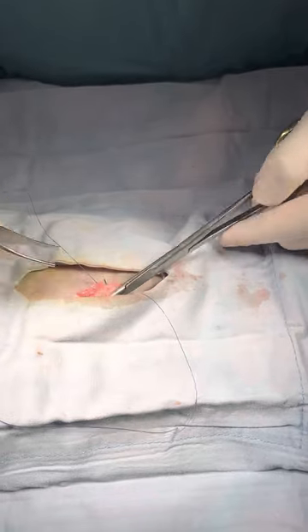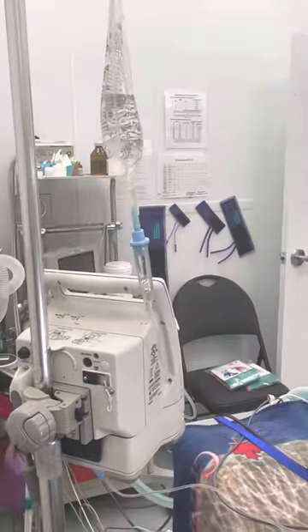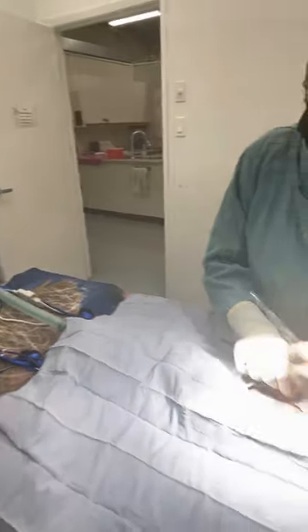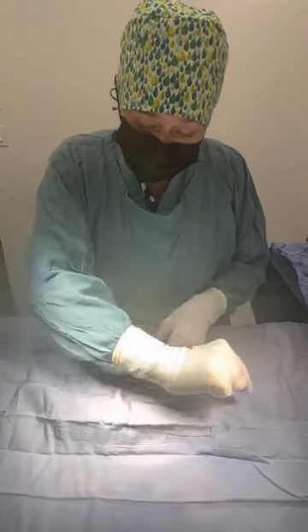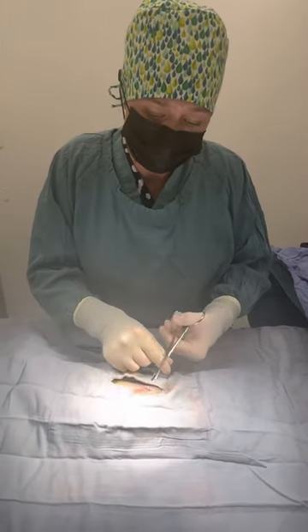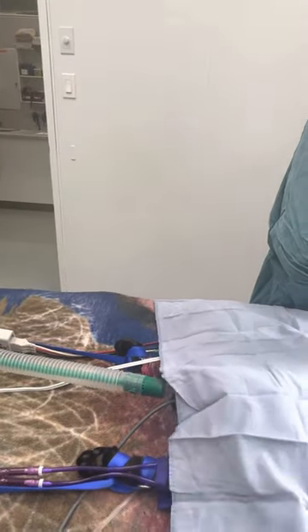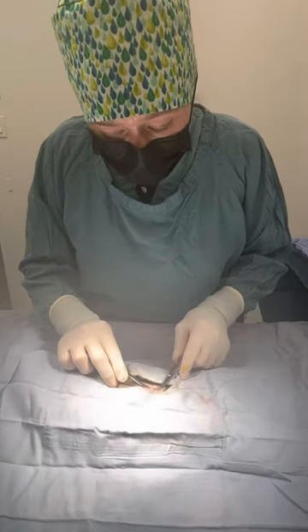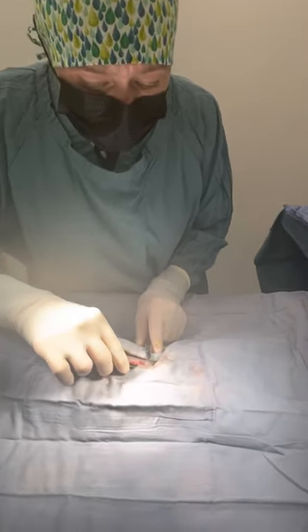You'll notice this cat is on an intravenous drip so we have full access to her circulatory system at any time. She's also hooked up on an ECG which checks her heartbeat as well as the electrical conduction in her heart. She's also on a capnograph — a CO2 monitor — which makes sure that she is breathing properly. She has a temperature thermometer down into her esophagus so that we know she's at a good temperature. We have an RVT monitoring her the entire time she is under anesthetic. She has an endotracheal tube in her throat so that we have 100% control over her airway, and if we need to use any medications or a ventilator we can do that readily.